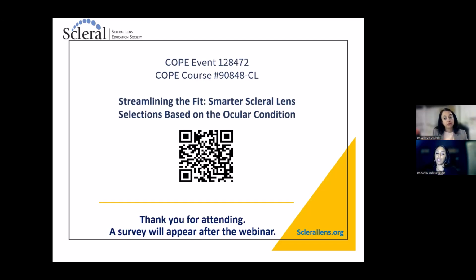Can you give us an overview of how you are measuring haptic locations? There's a general question about how you're measuring the rotation of the lens. Yes. So I take an optic section in the slit lamp. I have a white light optic section, get it nice and focused, and then I move my beam and line it up, because there are going to be two markings, right? They're going to be 180 degrees apart, and I line that beam up equally with both of the markings. Even better if it goes right through the center of the pupil, but if the lens is sitting a little inferior, it might not. You line it up with both, and then I just read the axis off the top of my slit lamp, whatever axis that is at.